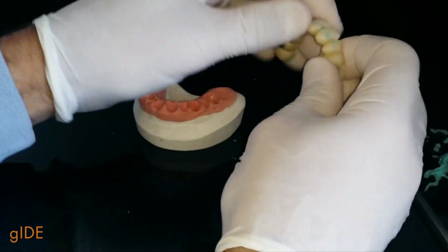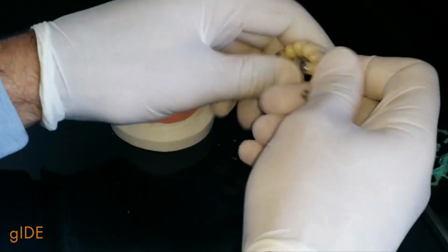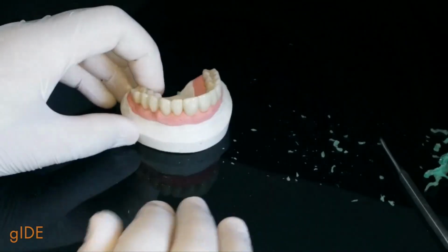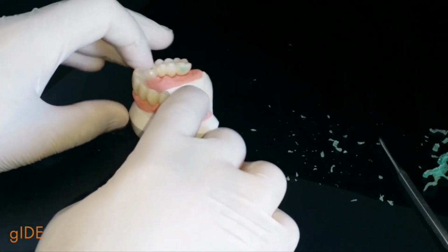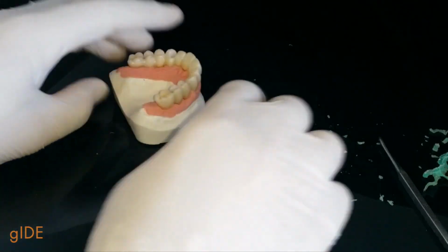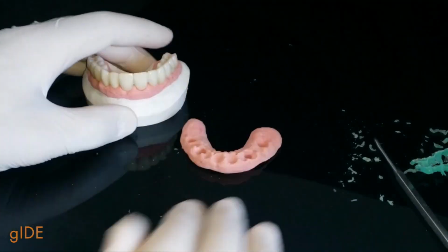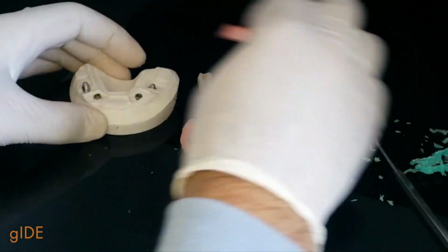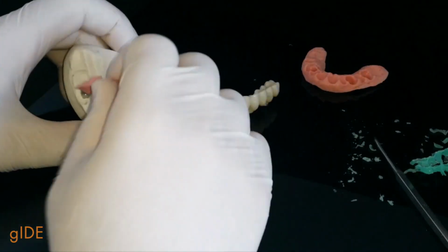And now it's interesting to see, if I try to place the temporary restorations on the soft tissues that I took with the second impression, you can see from the video how the blending between the temporary and the soft tissue is ideal. So on this model, the dental technician can really realize a good framework.